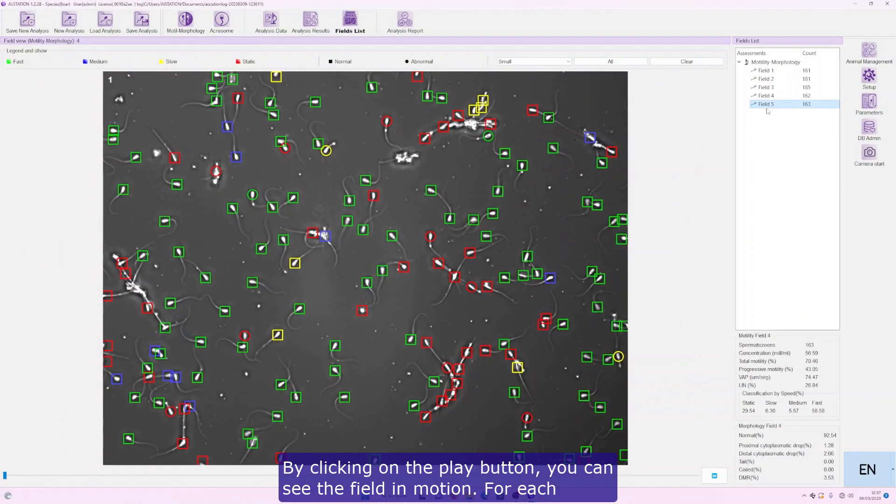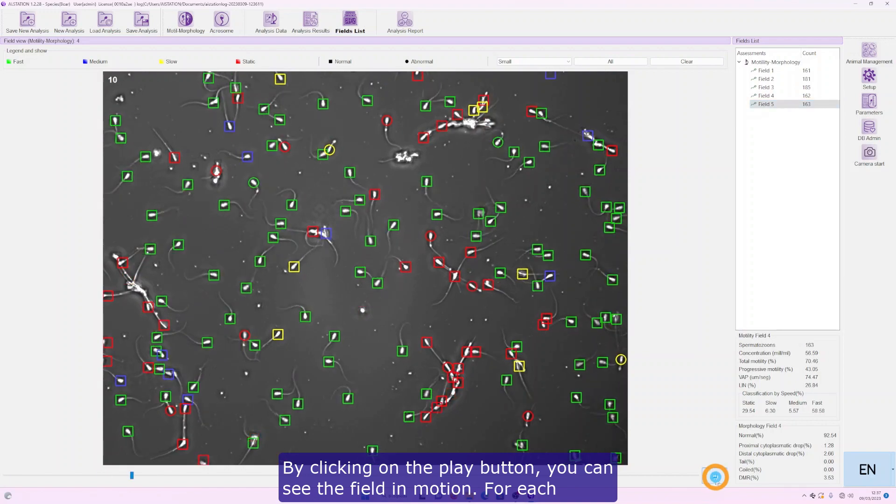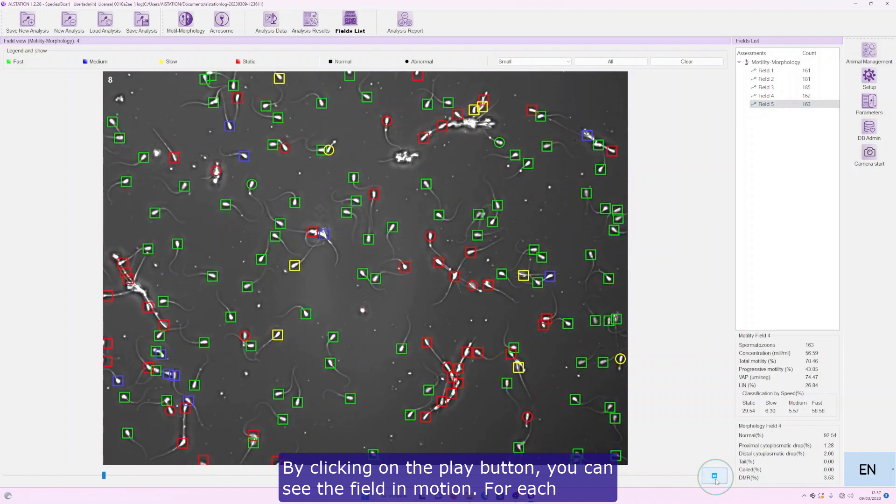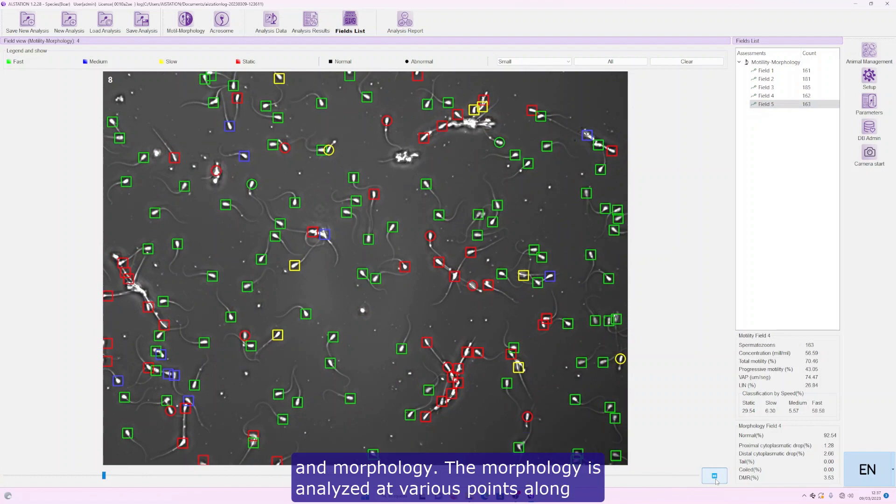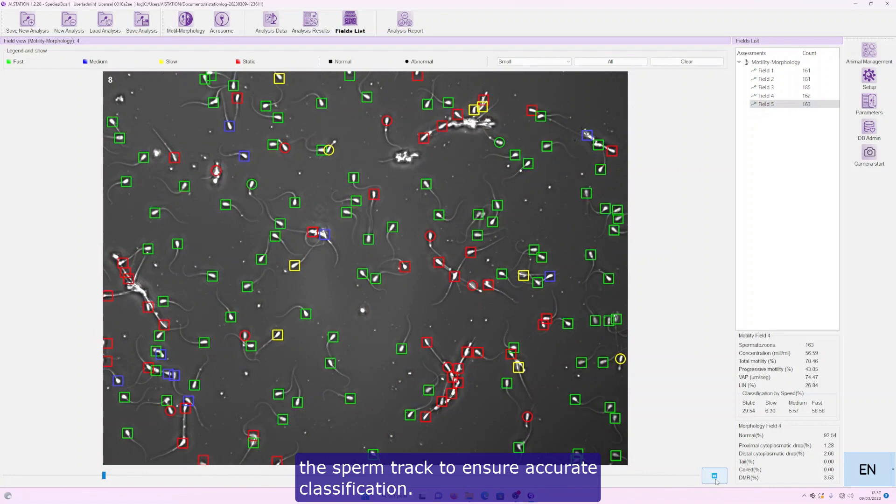By clicking on the play button, you can see the field in motion. For each spermatozoa, AStation simultaneously analyzes its individual motility and morphology. The morphology is analyzed at various points along the sperm track to ensure accurate classification.